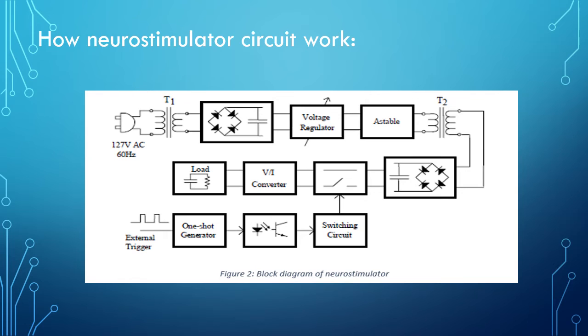Because the primary of the step-up transformer T2 loads such a circuit, the oscillation across the secondary reaches large voltage amplitudes and provides the compliance voltage required to provide the desired stimulation current.